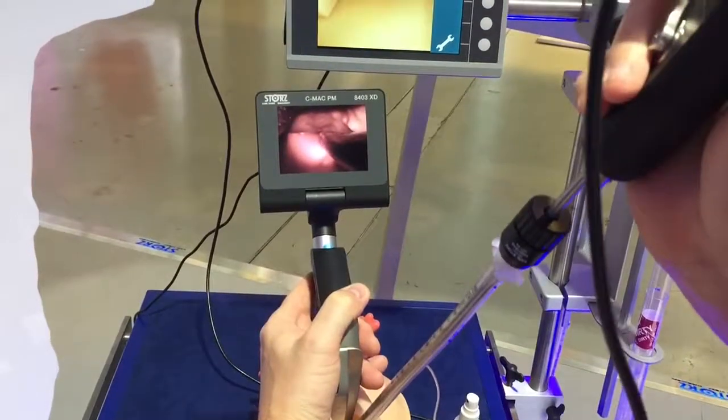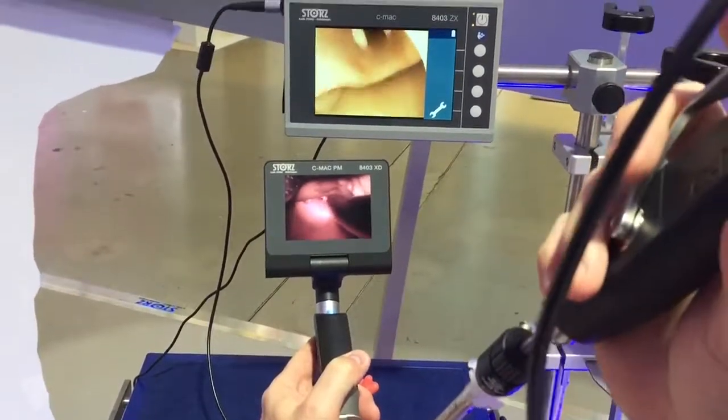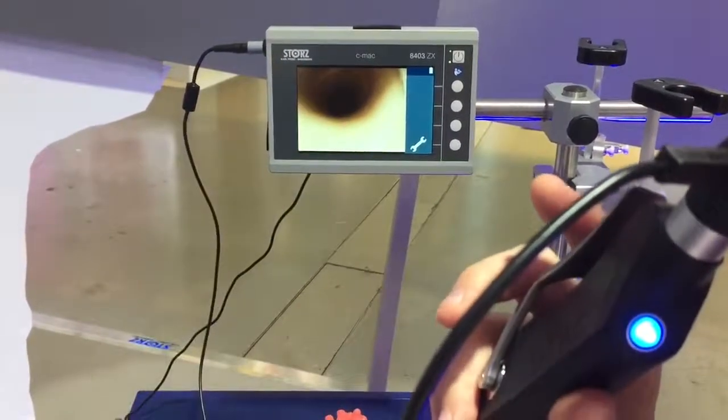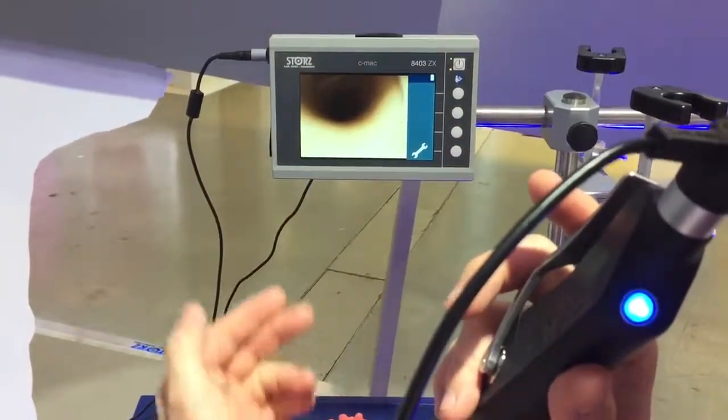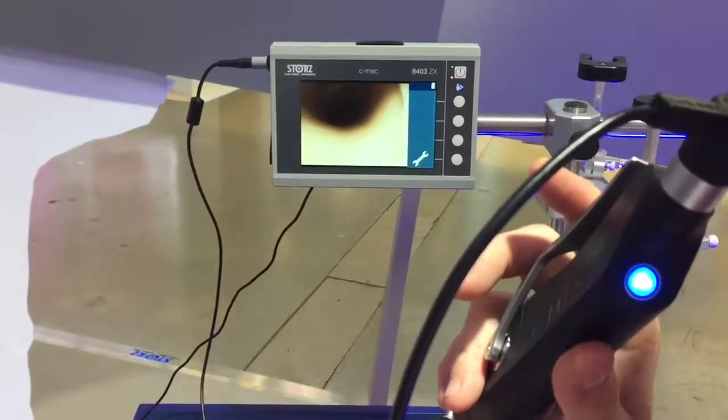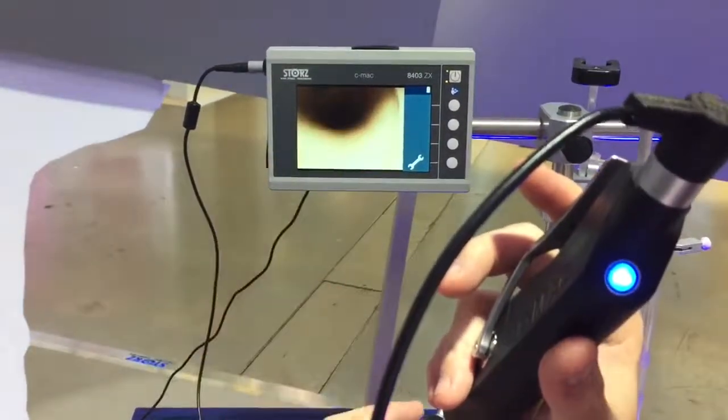And the fact that I can see the tube approaching — I get into the ballpark and then I use the endoscope to make the final approach, put the tip through the vocal cords. Again, I've got confirmation of tube placement. You can see there's no subglottic problem. I know that my failed intubation was not a subglottic stenosis.